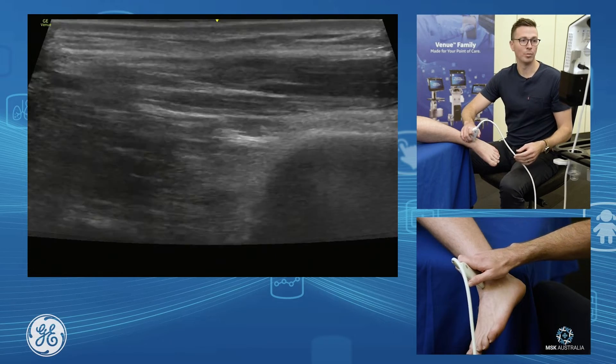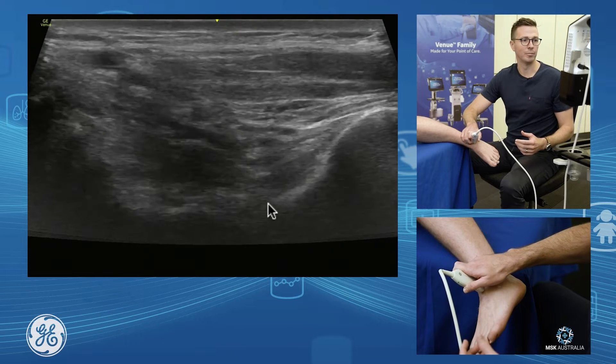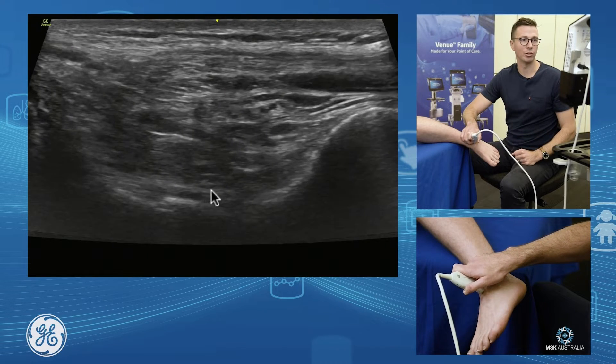Find your tibia, grab your probe, put your probe on the front, find the front of your tibia, go down off your tibia onto your talus, and through here we can see our anterior joint.